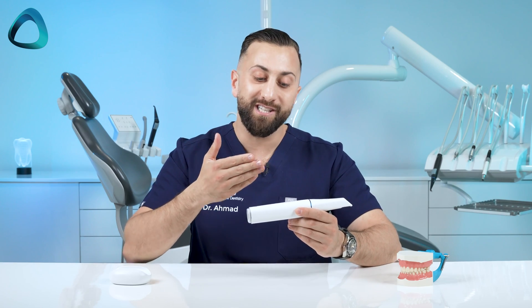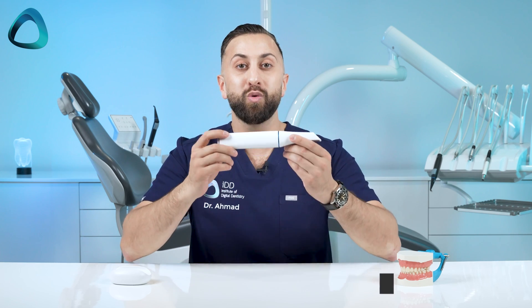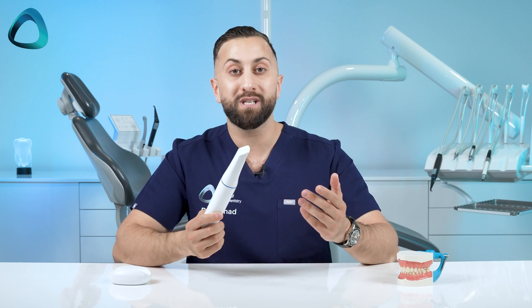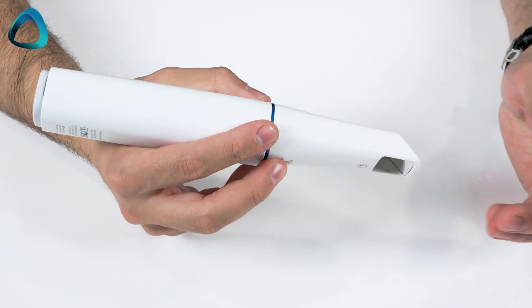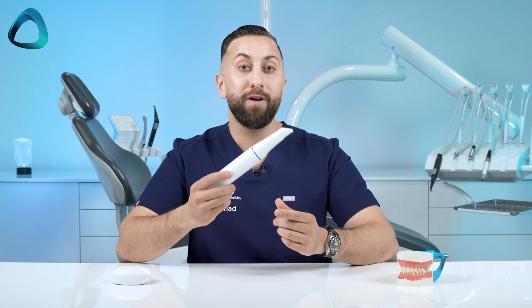So what about the new scanner body? One interesting thing about this scanner is the new symmetrical and unibody design. This means the i900 is totally symmetrical and made from one piece, which not only prevents the risk of cross-contamination but also keeps the i900 clean. It also means you can hold the i900 in any position you like, as it's very lightweight and easy to hold for anyone on the team.